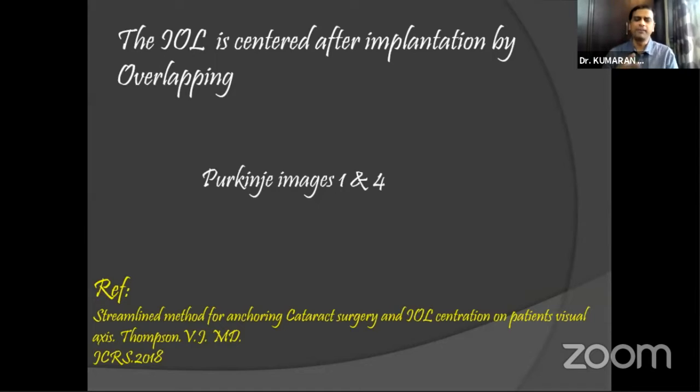As I told you, in a perfectly centered capsular rhexis, the IOL normally centers itself in the bag. So most of this has to be decided preoperatively, whether this patient should get a presbyopic correcting IOL or not. However, when you have a compromise in the capsular rhexis margin, the IOL can change its position. The only lenses where you need not look into the IOL centration are the PMMA lenses or the spherical lenses, but nowadays spherical lenses are not used much. Most lenses are aspherical, and for all aspherical lenses you need IOL centration, even more so when you're using toric or multifocal lenses.